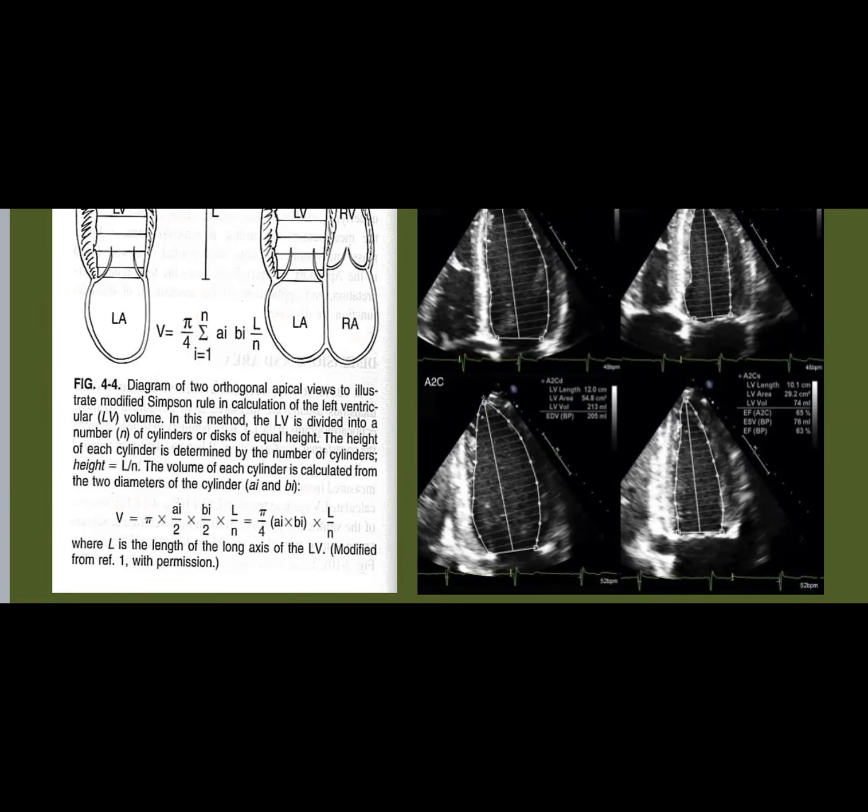The eyeballing done by echocardiologists had an inter-observer variability that reached up to 10%. You are an echocardiologist and your colleague is just beside you, and you can vary by eyeballing up to 5%. That is not good when we are talking about precision of ejection fraction, okay? We have to be more precise, more objective, and more reproducible, and reach the same answer.